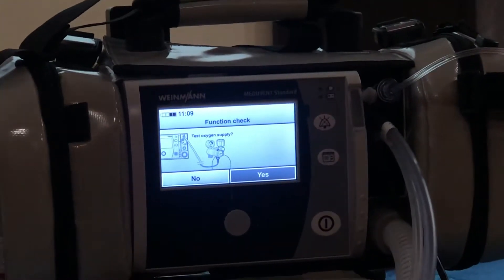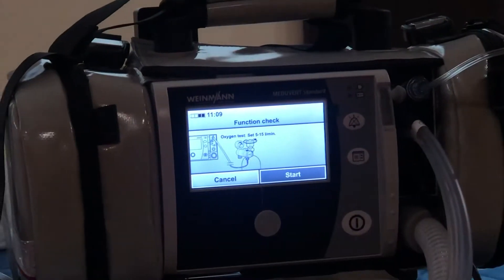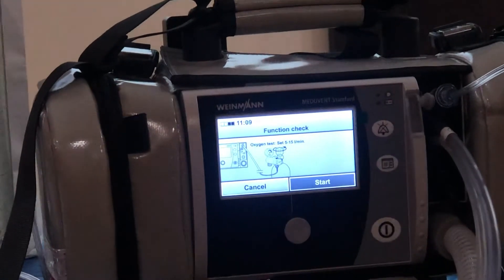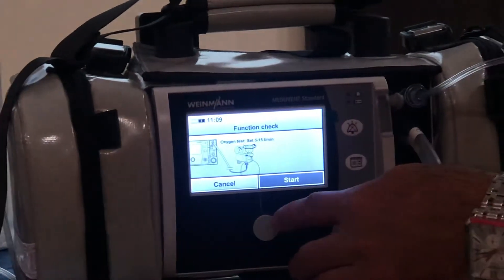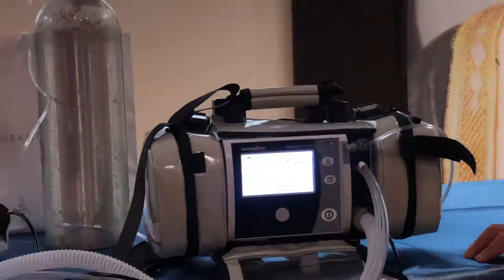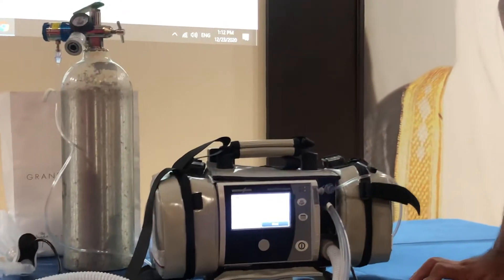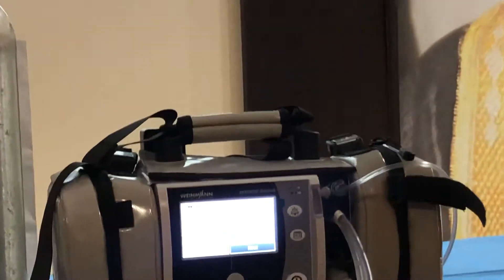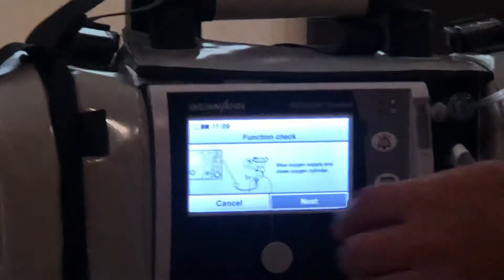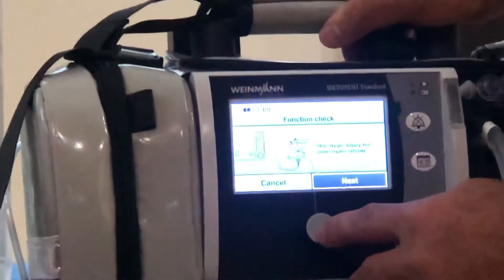Since we are connected to an oxygen source, we need to do the oxygen test. The oxygen test is really optional — you don't have to do it — but follow the instructions. Make sure that this is correct. Open it. Start. Stop oxygen. Close oxygen.